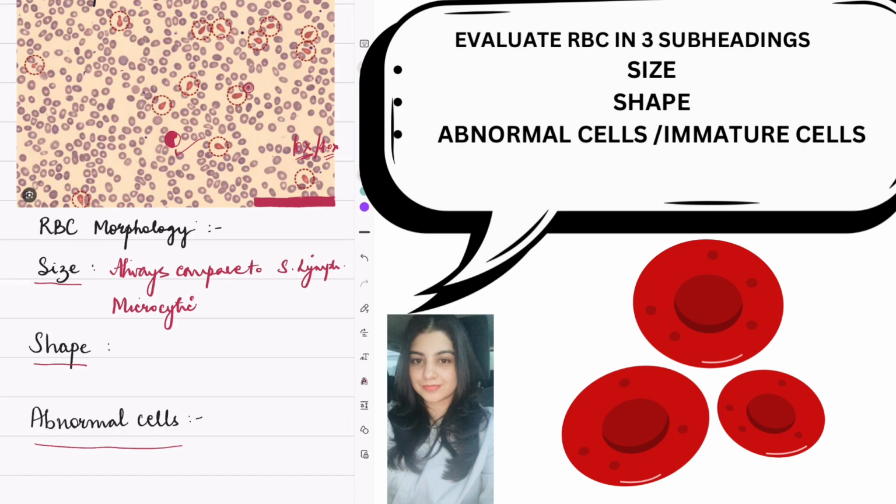So if anemia is severe, it will be more than 1/3. But in this, pallor is there, but not that much. It's not covering more than maybe 1/3 of it, right? But still we can say that this is hypochromic.